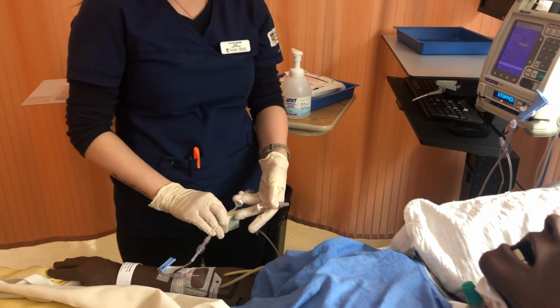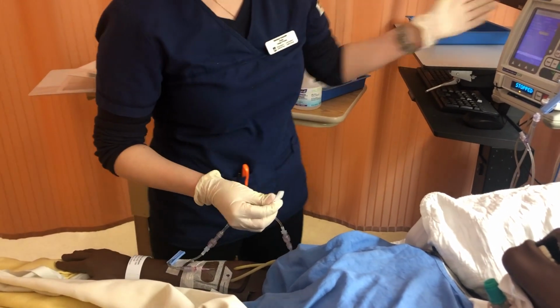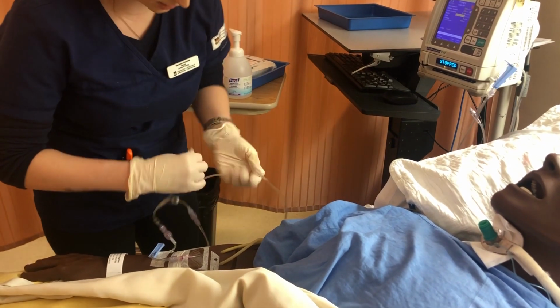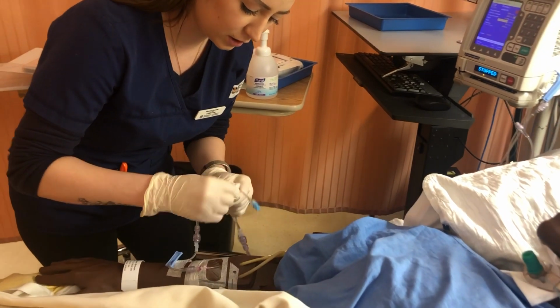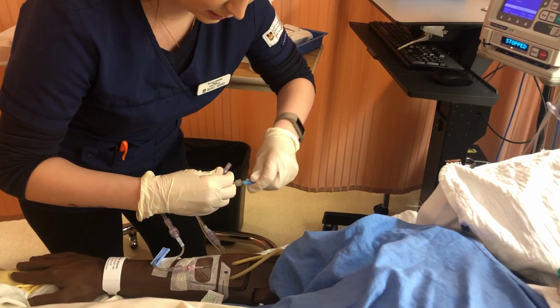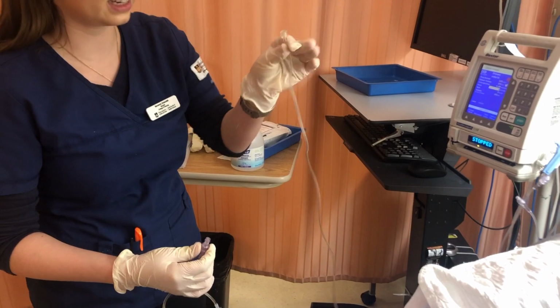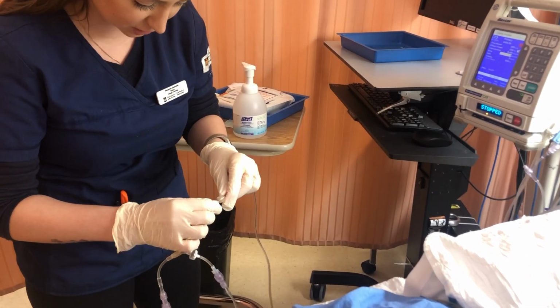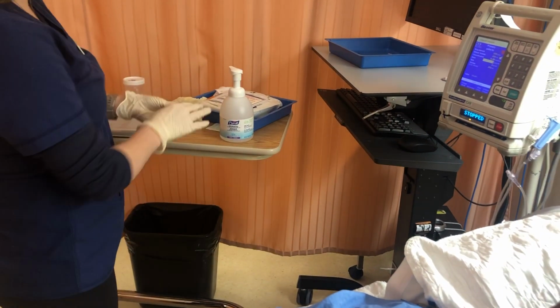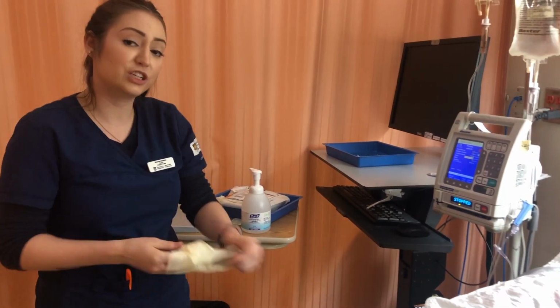This Y port has been attached and primed for me, so I'm just going to clean it and grab my continuous infusion line. So I will swab it for 30 seconds, let it dry for 15, and I'm just making sure that this line, which has no ports, is properly primed, so I can see a bleb at the top there. All right, so before I press start on the pump, I'm going to get my buddy nurse to come and do my third med check with me.